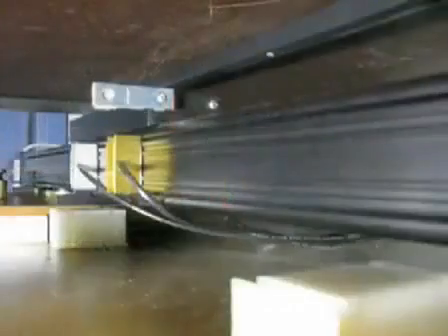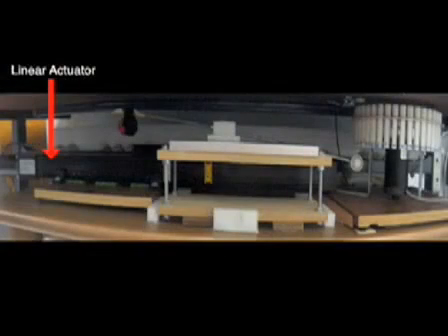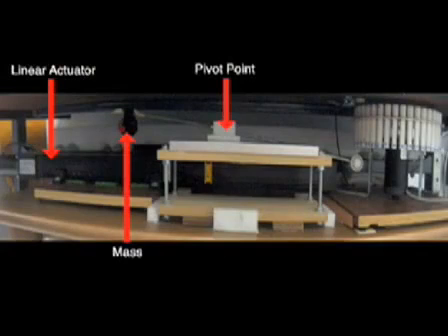The mechanical components of TAPS are shown here. When the carriage of the linear actuator moves forward, the hanging mass is allowed to fall under the influence of gravity. The weight of this mass and its distance from the pivot point along the rotating rod together determine the upward force with which the stimulus piece contacts the subject's skin.